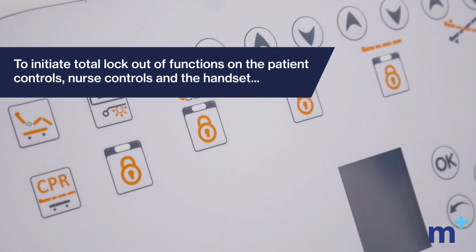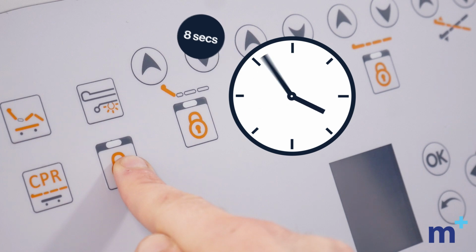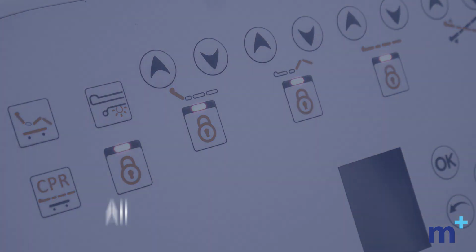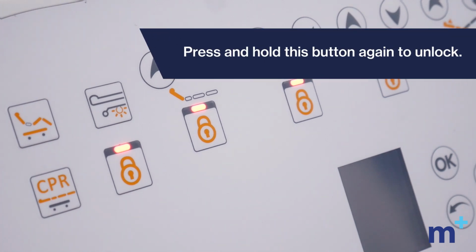To initiate total lockout of functions on the patient controls, nurse controls and the handset, press and hold this button for 8 seconds. Again, a red light will illuminate to show all functions are restricted except for CPR. Press and hold this button again to unlock.